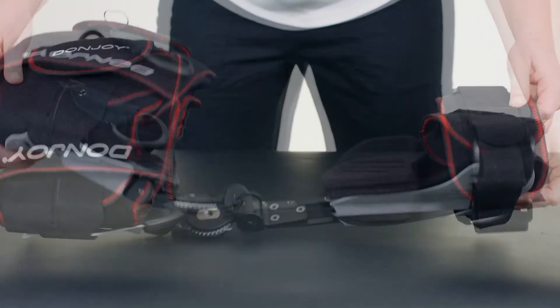Extra padding: attach the mid thigh pad as shown.